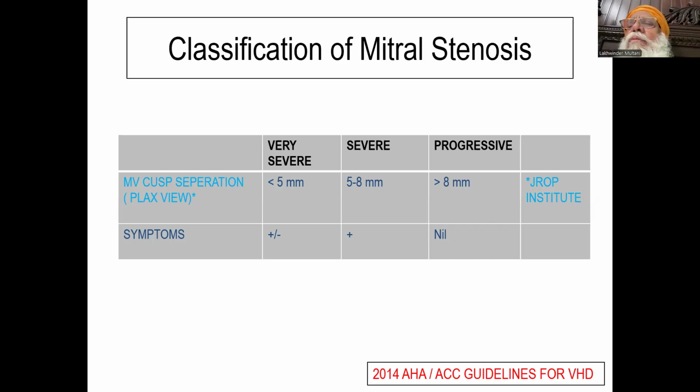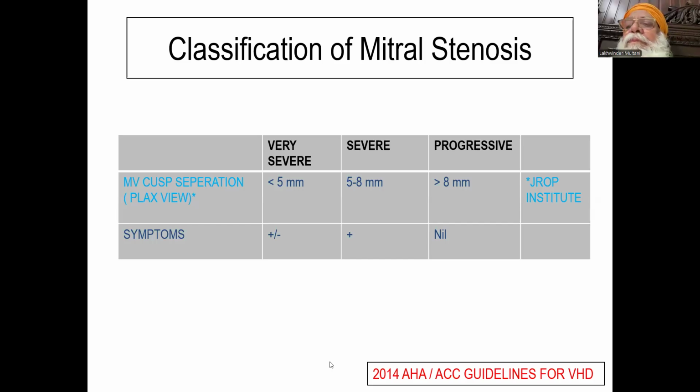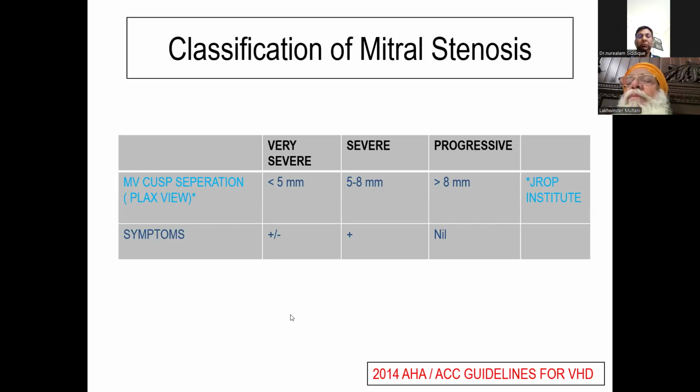Prolapse is an anatomical feature. Subvalvular apparatus. Subvalvular we can see straightforward. The patient having atrial fibrillation. Atrial fibrillation was not there because we can see the mitral area and we can see the gradients. It was not an atrial fibrillation.